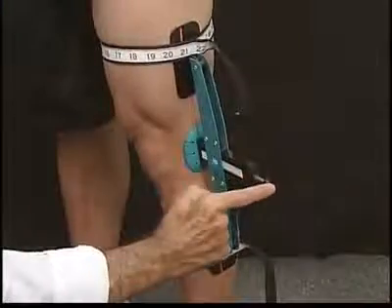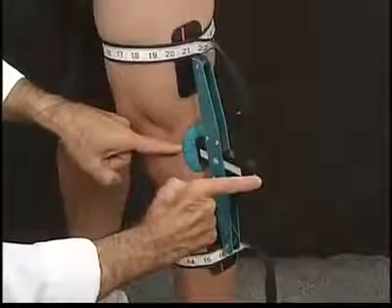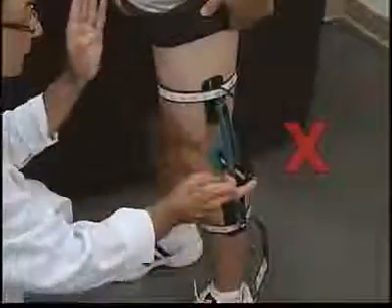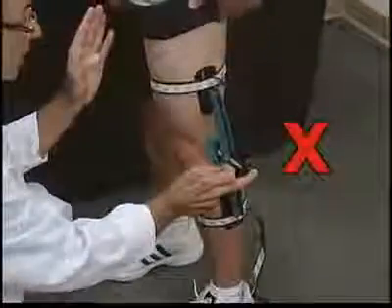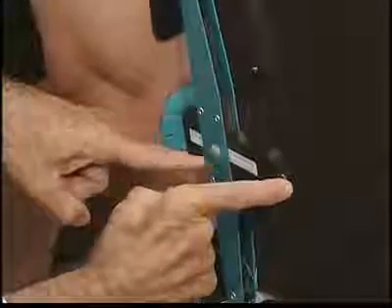Lastly, get the knee offset measurement by compressing the basket in with one finger a couple of times. Do not push hard enough to move the patient. Record the offset measurement when the basket is depressed all the way. Take the measurement on the offset gauge. In this case, it's fifteen.